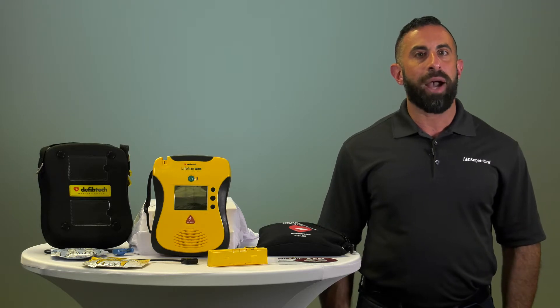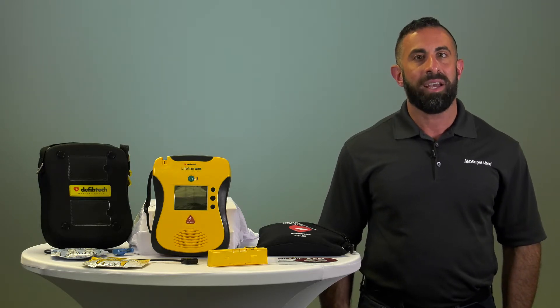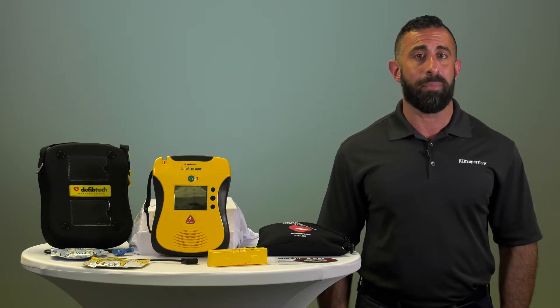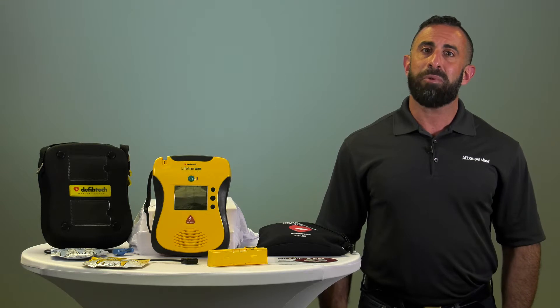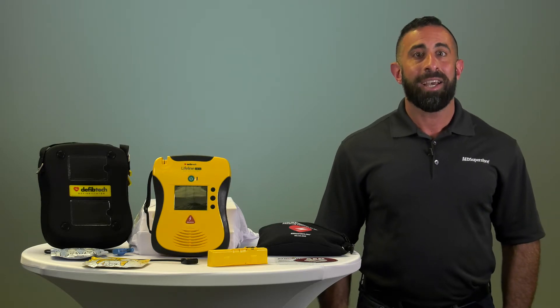The AED also comes with proactive reporting which monitors the status of the device. Expiration dates are programmed into the electrode pads and batteries, and they are displayed on the status screen with an alert when nearing expiration.